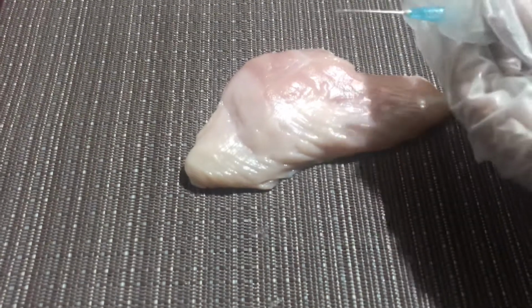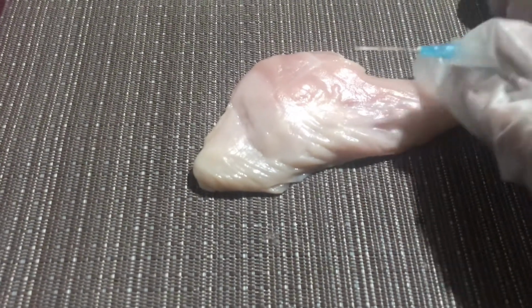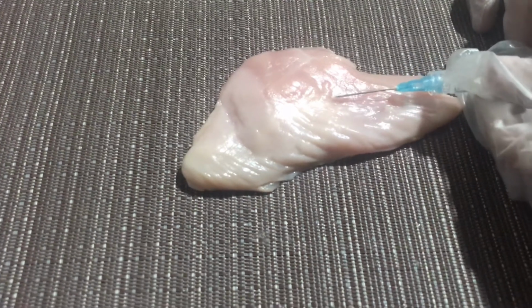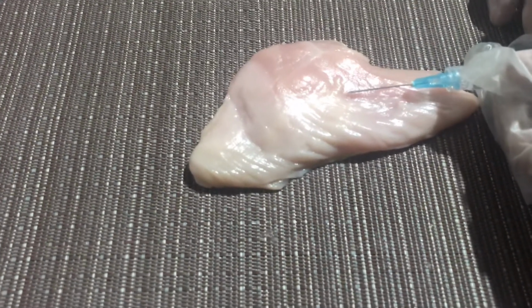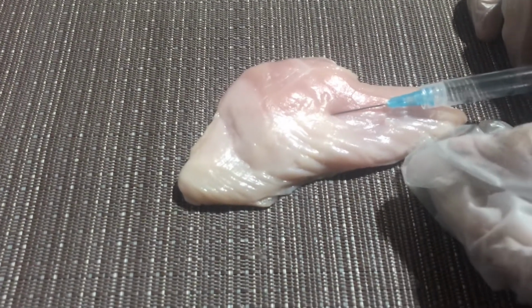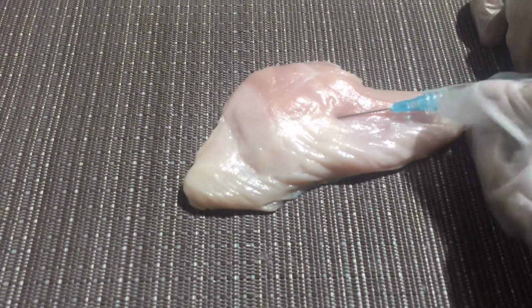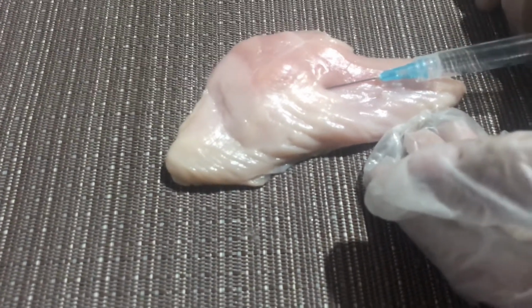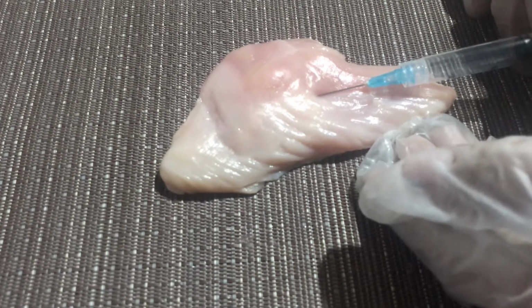Again, I will be putting this needle in at 5 to 15 degrees, and then I will slowly inject until I feel the resistance. I'm already inserting the medication slowly.